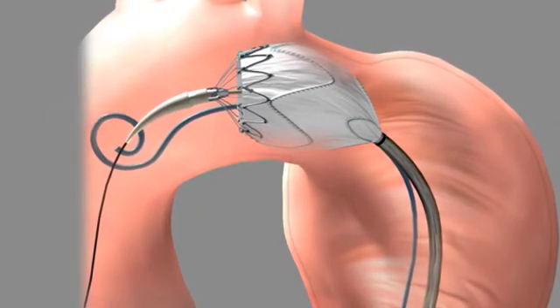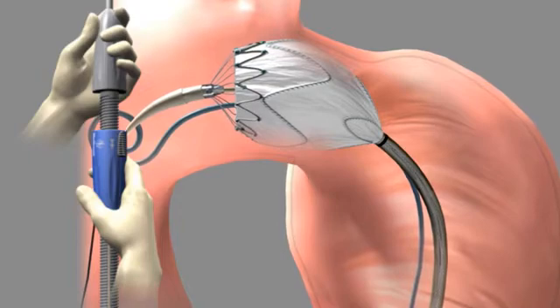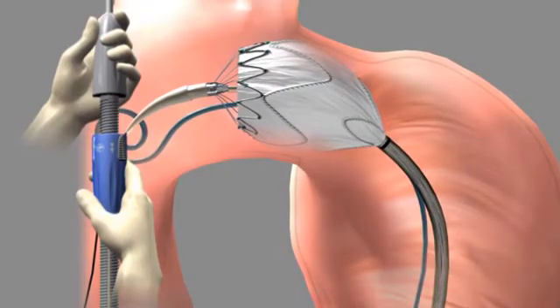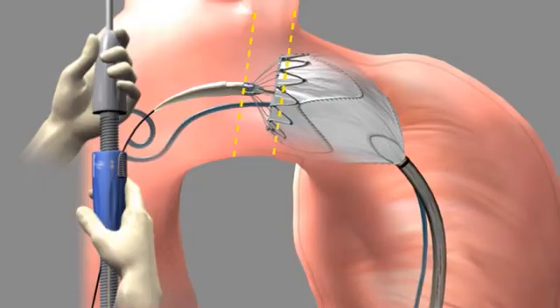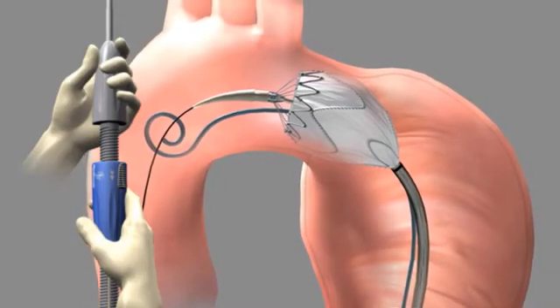Use angiography to verify the position of the stent graft. If the stent graft was deployed higher than the targeted landing zone, maintain the position of the slider and pull down on the entire delivery system until the proximal figure-8 markers at the top edge of the fabric are at the desired position. Do not advance a partially deployed system as it may lead to aortic perforation.